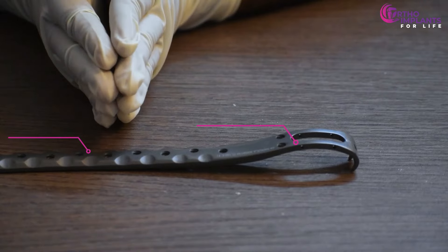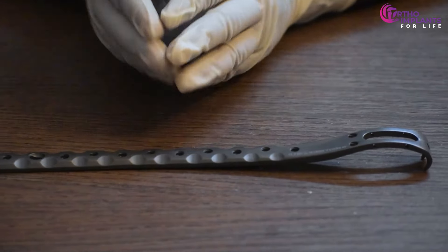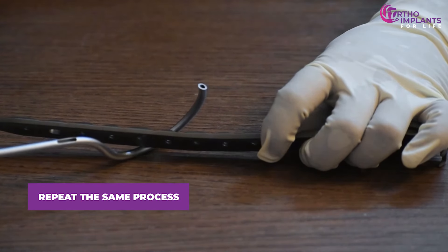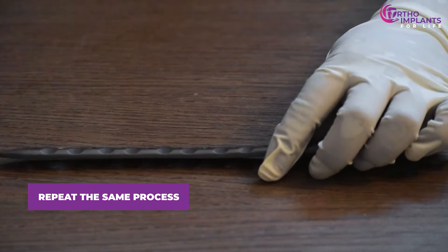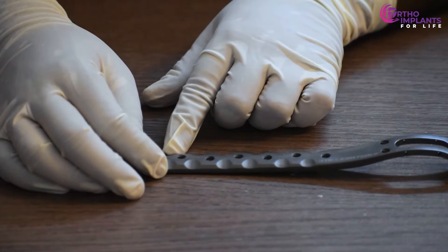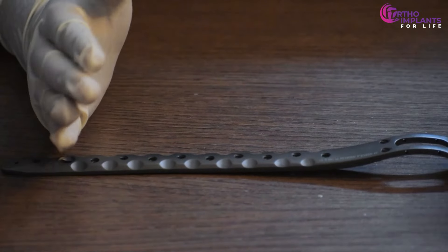The doctor now decides whether to do cable fixation in the distal part of the plate. If needed, we repeat the same process — pass the cable guide from the bottom of the plate and insert the wire through this hole so it comes out from the other end. Though there is no hole at the distal end as there was at the proximal end, we can use a wire mount later to fix the cable. Once we have checked that the bone and plate are in place, we will start locking the cables one by one.